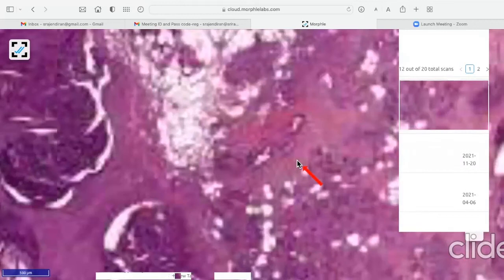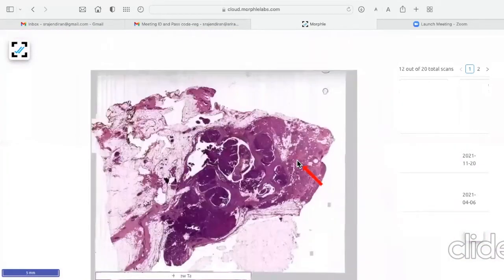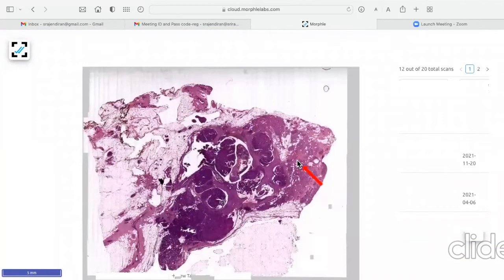If you go to the exam, my tip for PGs is, don't just see, put the slide directly under the microscope. See it grossly. This is the appearance you look on the slide. Then you can appreciate something.